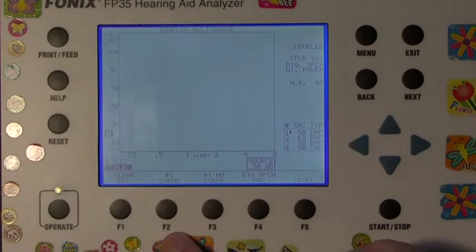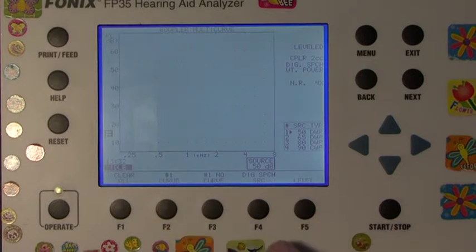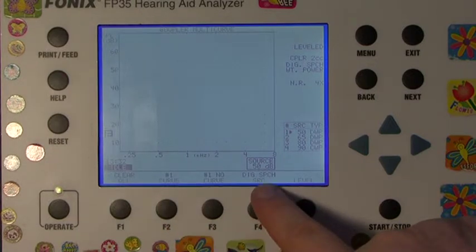Above the F2 button on the screen should read Curve 1. If not, press F2 repeatedly until Curve 1 is shown. Above the F4 button on the screen should read Digital Speech, shown as DIG SPCH.